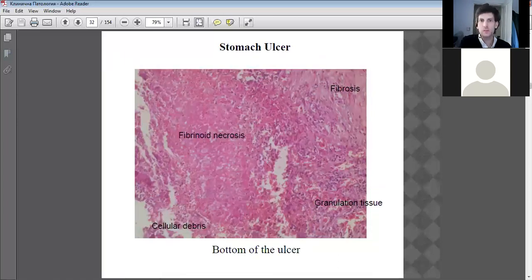Here's a nicer example, more magnified, where we can see more of the degradation of the tissue. And I like the difference. We can see the fibrous tissue there, massively impacting the granulation zone, but the necrosis is becoming more evident. Now, the breakdown or death of cells causes lots of little spaces, and you can see these spaces here forming, and eventually a big area forms.